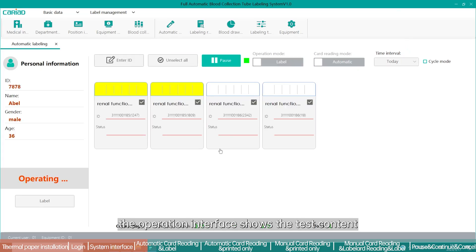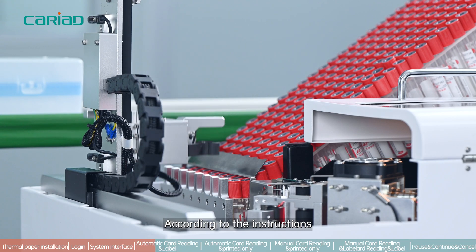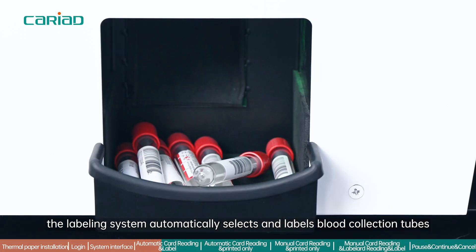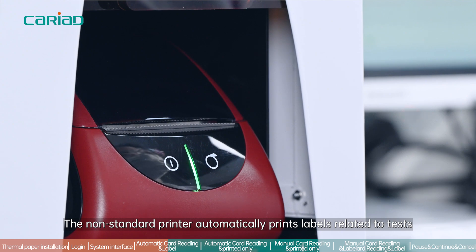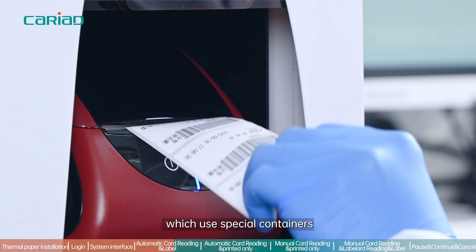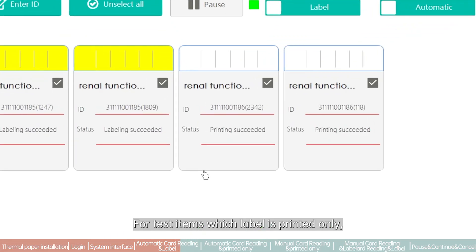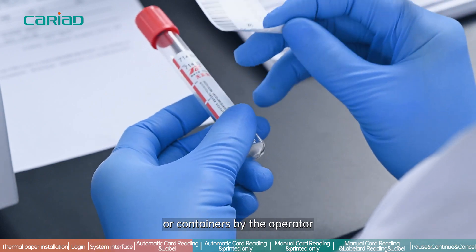In the mode of automatic card reading and label, after reading the card or scanning the barcode, the operation interface shows the test content. The system automatically issues labeling instructions; according to these instructions, the labeling system automatically selects and labels blood collection tubes. The non-standard printer automatically prints labels for tests using special containers, which are marked in white at the top in the interface. The printed labels are then affixed to the corresponding sampling tubes or containers by the operator.